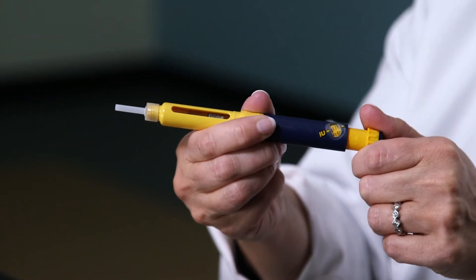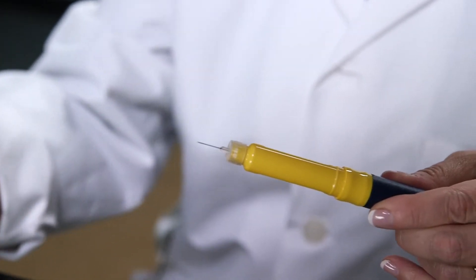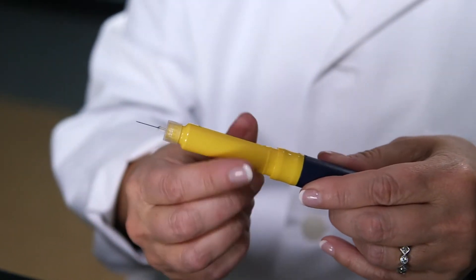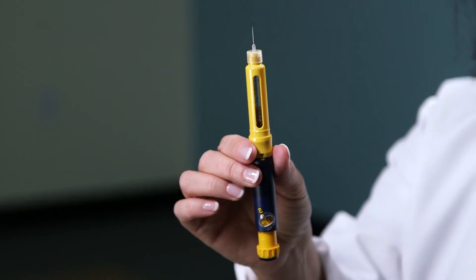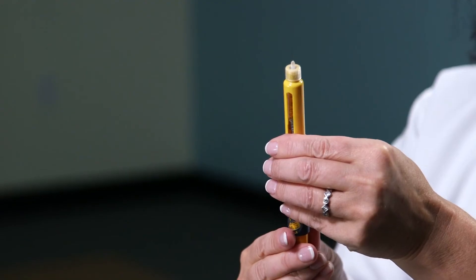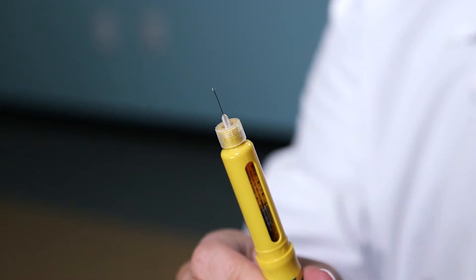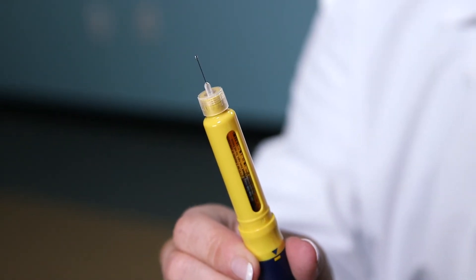Dial up to your prescribed dose. Remove the inner needle cap and you should see a droplet form at the tip of the needle as it self-primes. If this does not happen, you'll need to dial the pen one little click and press until you see a droplet form.